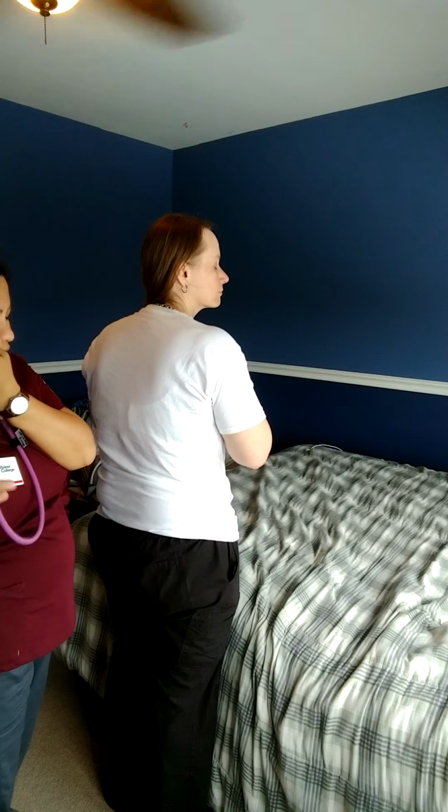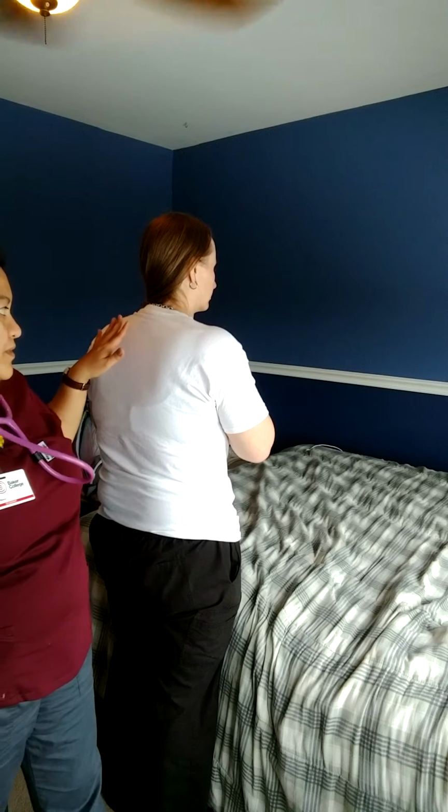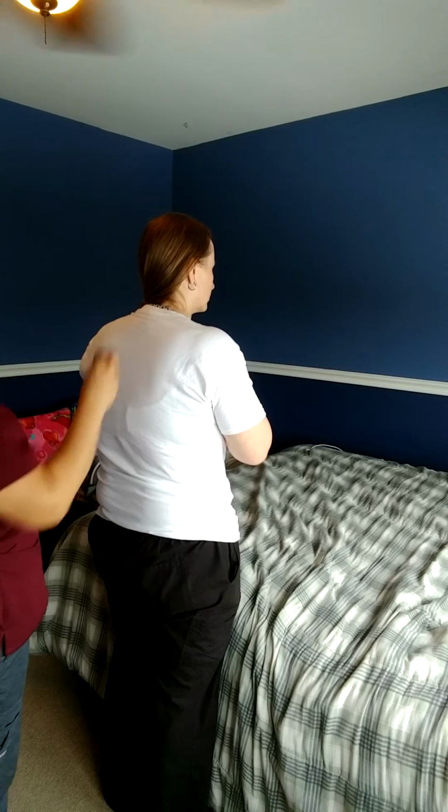So I just need you to take a deep breath, okay? Again, for a real patient, you have to auscultate through their skin. But for the sake of this video, I'll just auscultate through her shirt. Okay, take a deep breath.